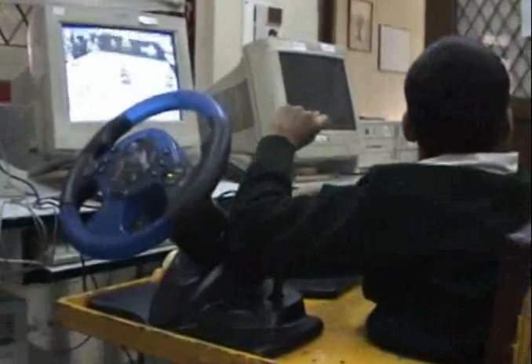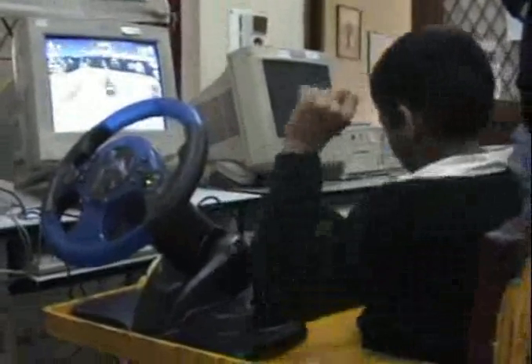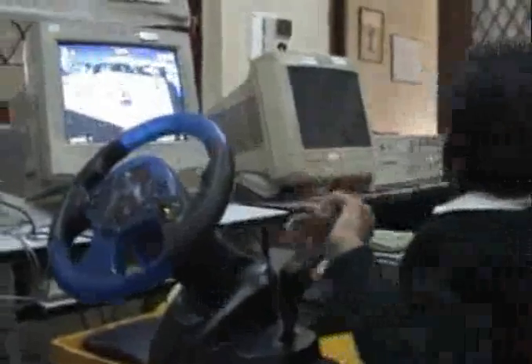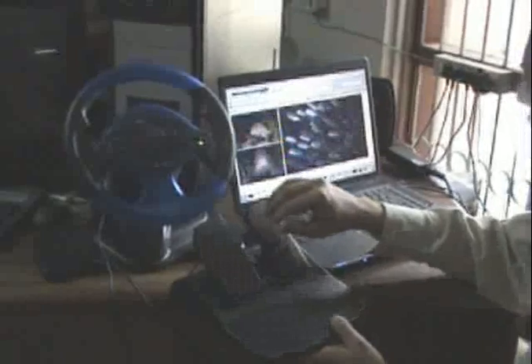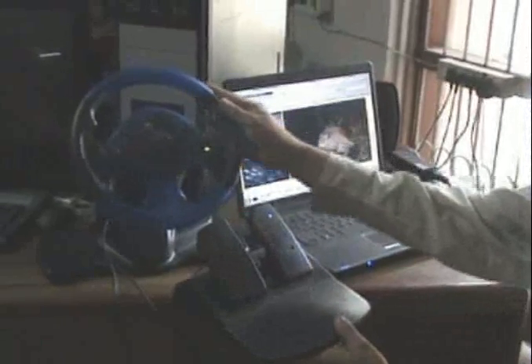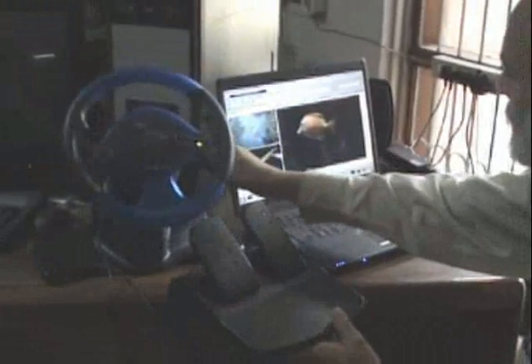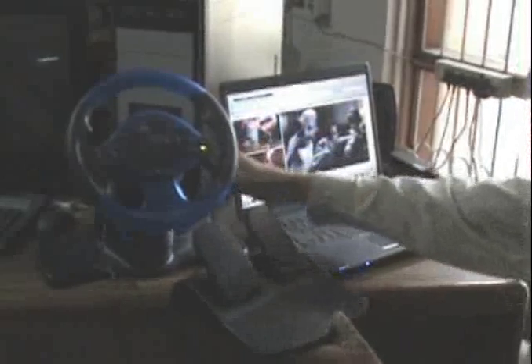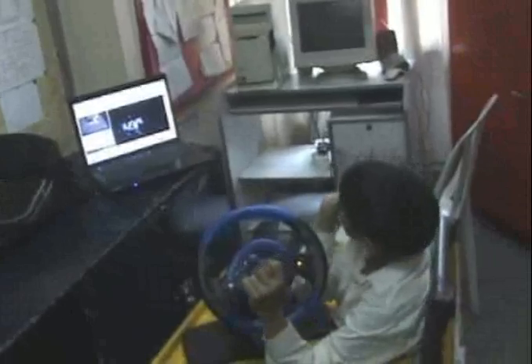Next, having figured out that he can use this device quite conveniently and he enjoys doing so, we had to think of software that might work for him with these very simple controls. The first software that we wrote for Arpit to try out was a simple picture browser where you can change the picture that you are looking at. We are looking at fishes now, and by either the wheel or the pedal you can change the photographs. Now every time we press the stick, we change the category of pictures that you are able to look at. That worked quite well for Arpit, and he was very engrossed with that.